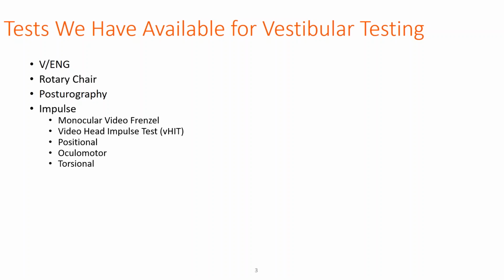You can use it to really be this multi-dimensional tool that you can maybe even use as an entry point to vestibular testing. And then there's evoked potentials such as electrocochleography or ECOG, the auditory brainstem response or ABR, as well as vestibular evoked myogenic potentials.